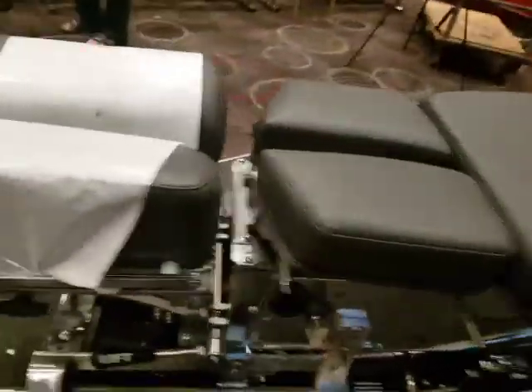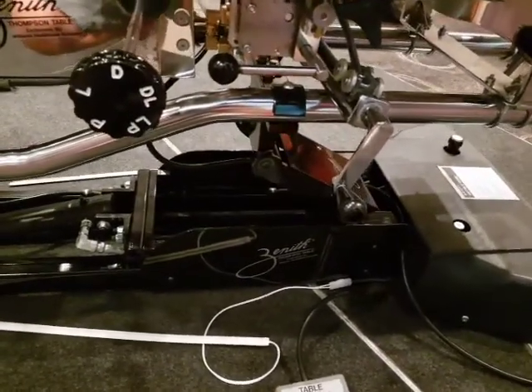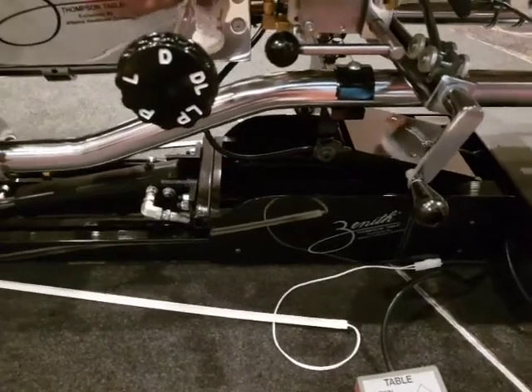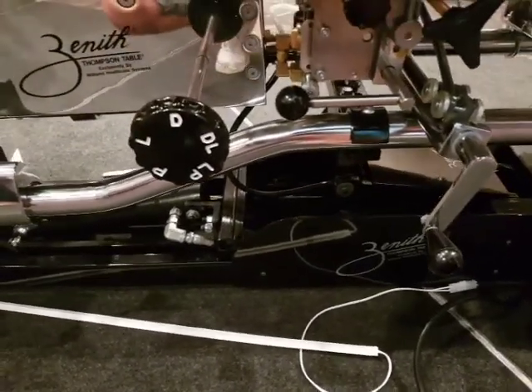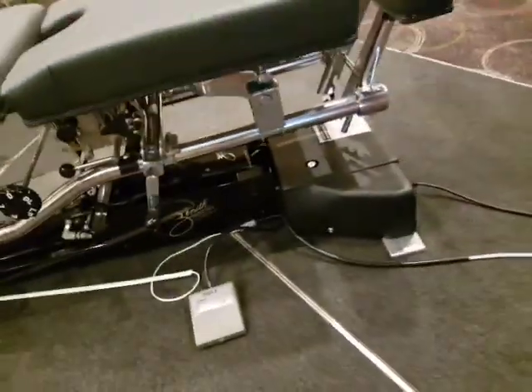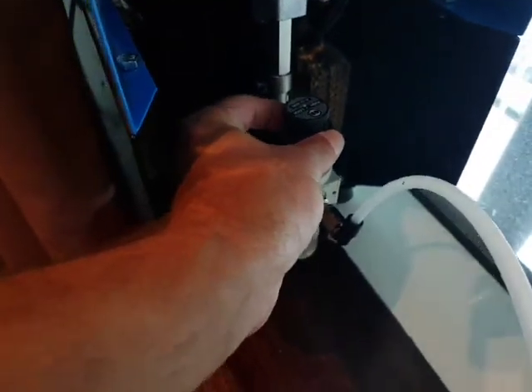To raise and lower the table, use the foot pedal — all the way up and all the way down. There'll be two foot strips, one on each side of the table. When you hook up the compressor, you want to set it to around 80 PSI, adjusting the pressure with this knob here.